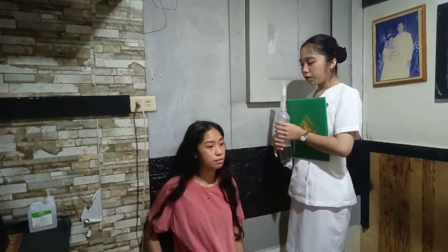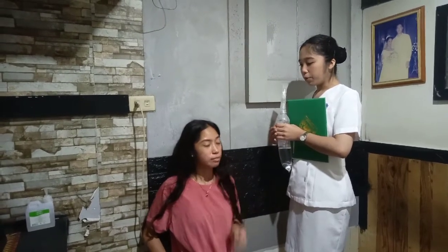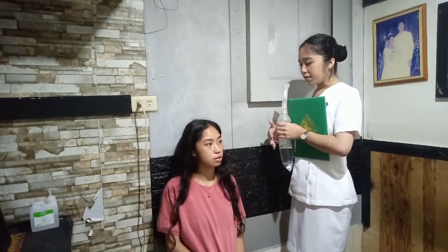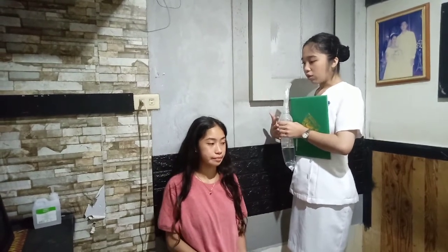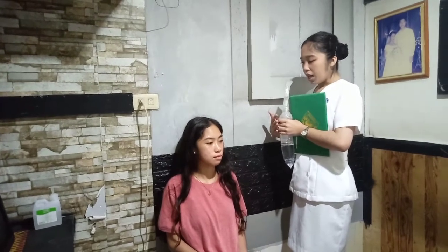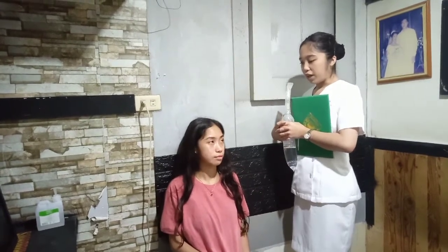The reason for this is to assess your inspiratory activity and for your deep breathing exercises. This procedure is also done after post-operative surgery in your lungs, to avoid any difficulty and to assess your lung capacity. Is it okay for me to continue with this procedure right now?